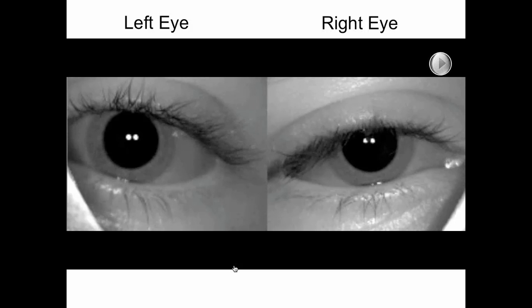And this is one of the areas where, again, video playback, where you can go back and you can look now that you don't have to entertain the child. You can actually do a very good clinical assessment by reviewing the images afterwards.